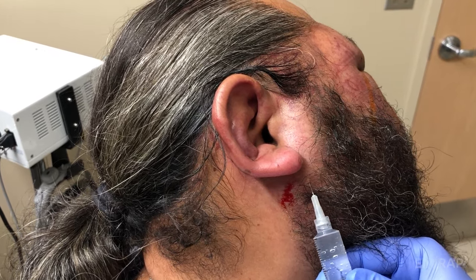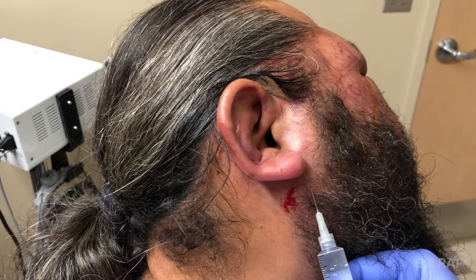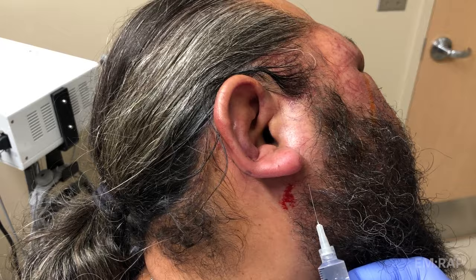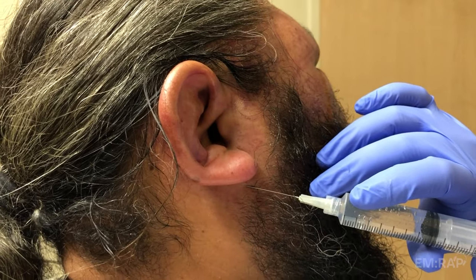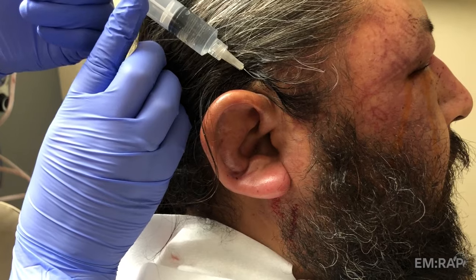Use plain lidocaine. Inject inferior to the ear — we're basically doing a ring block, so on the anterior side you're aiming up towards the tragus, and on the posterior side you're aiming to the posterior aspect of the ear. Always aspirate before you inject.